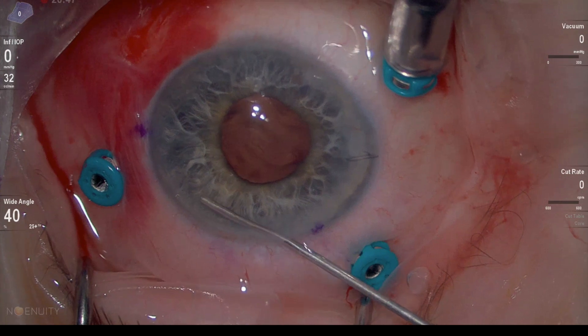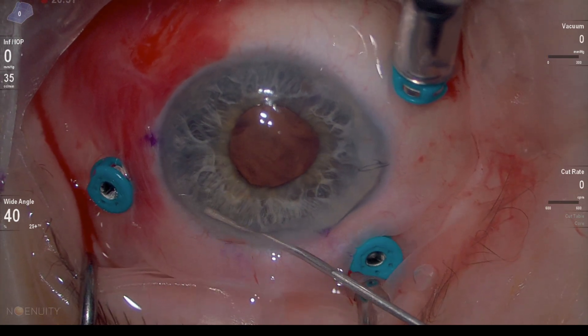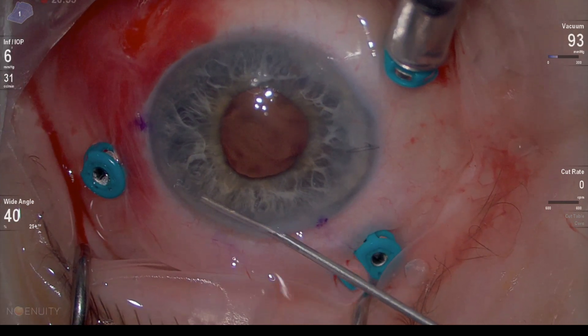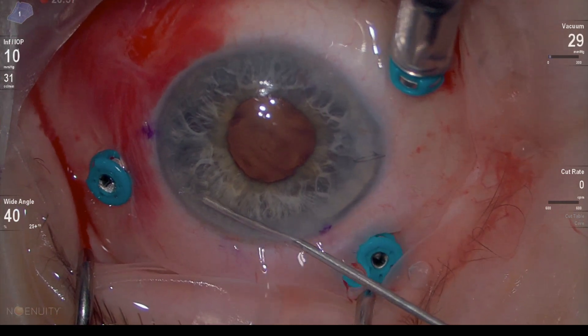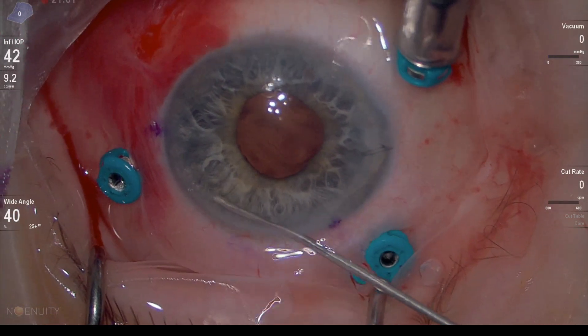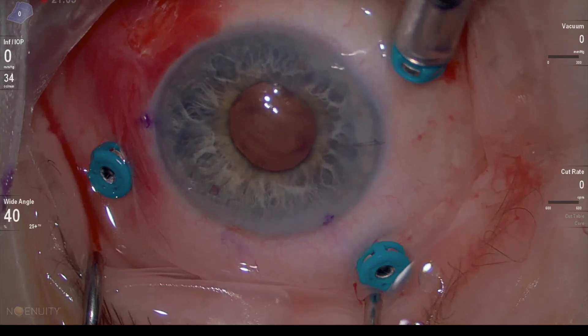Always remember to do a peripheral iridectomy with anterior chamber IOL. The easiest way to do it is to go with the vitreous cutter facing down, switch off the cutting for now, go with the vacuum, hold the iris, make sure you have a good grasp, pull up, and once you have a good grasp just activate the cutting.